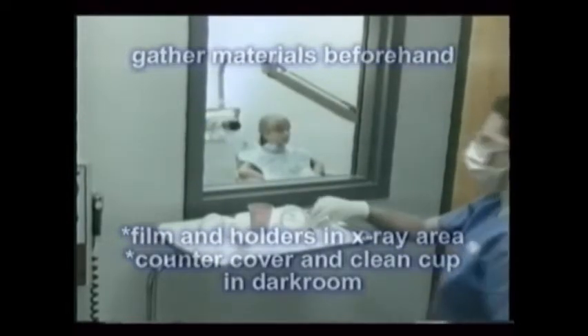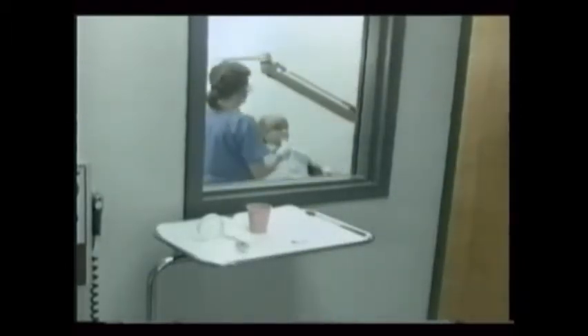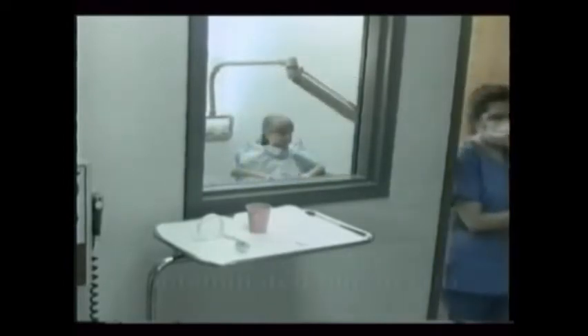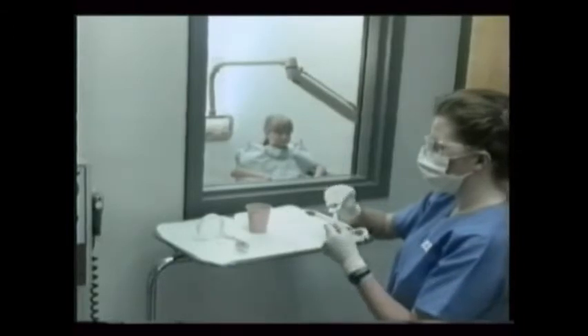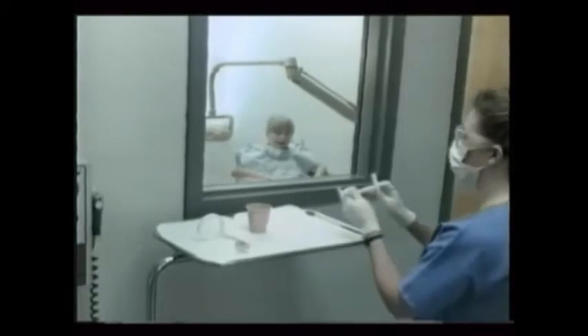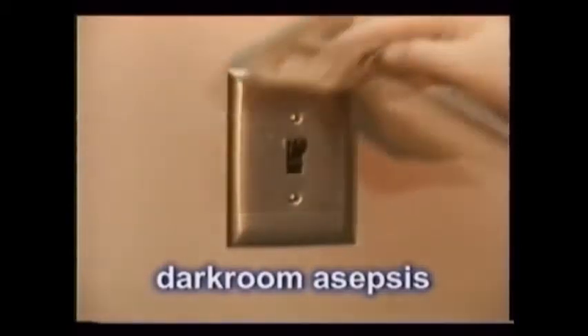And then the process is simple. After the x-ray room and the patient are ready, place the films to be used on a clean paper towel away from the x-ray beam. As each film is used, the now contaminated film is placed in an adjacent cup. When the x-ray procedure is completed, the patient is dismissed and the cup of exposed and contaminated film is moved to the dark room counter.